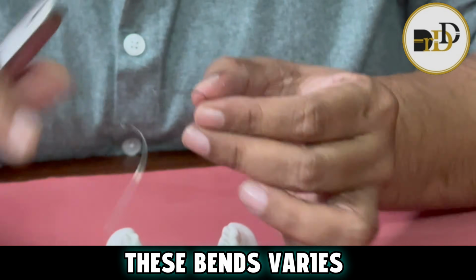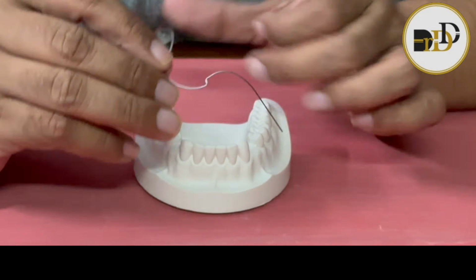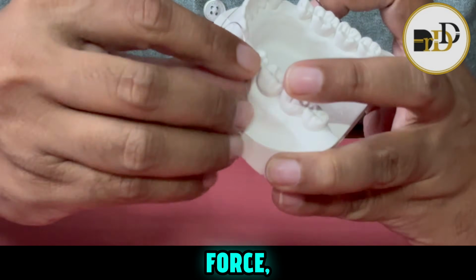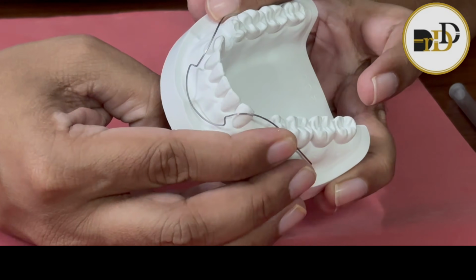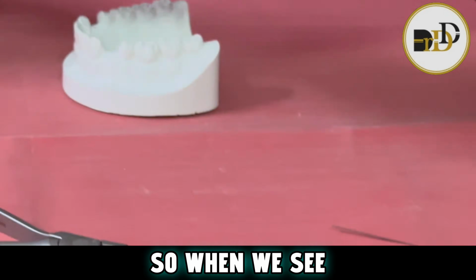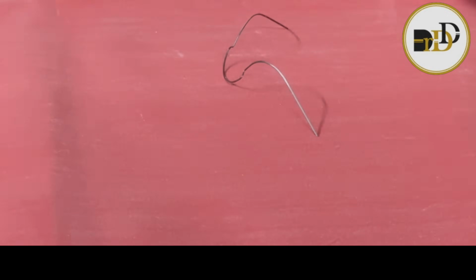These bends vary clinically from one patient to another, depending on the molar position. A simple check is that after giving the bend, when we check from the molar without any force, it needs to look like this in the vestibular area. So this is the vertical compensation. When we see, it is being compensated both in the horizontal and vertical.